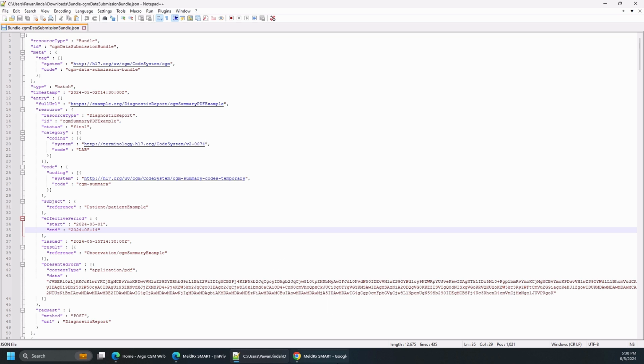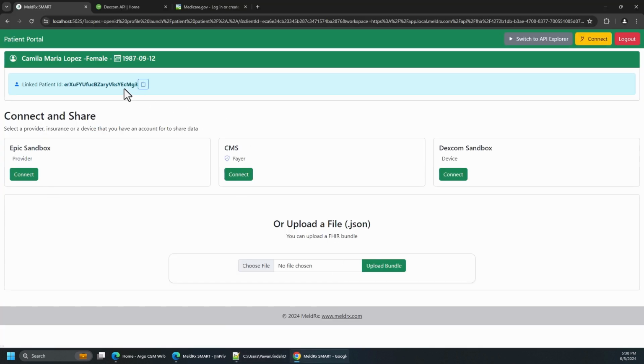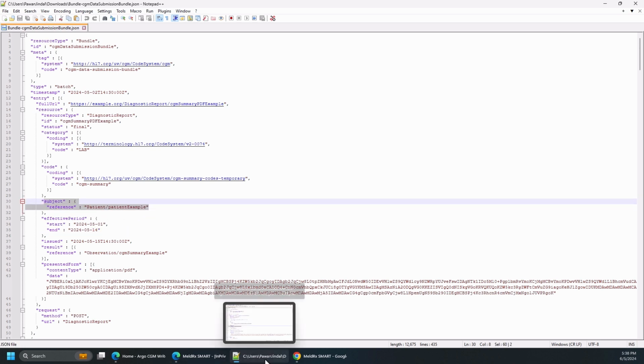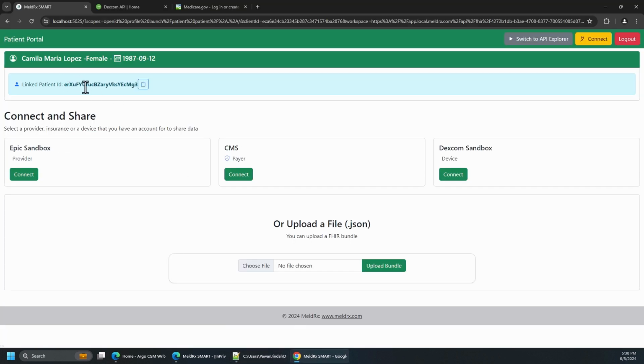The scenario in here is that I have a patient account that can connect to that device. It can pull the data from there. Somehow it will convert that data into FHIR, and then we want to push that FHIR data back into that linked FHIR server for the provider to see together with the rest of the data. The key here is that this CGM data, the data coming from the device, will ultimately have a patient reference in there, and this patient reference should be updated with the patient reference in the linked FHIR server that it is being pushed into, which will then make it available with the rest of the patient data in the FHIR server or any app that is connecting to it.